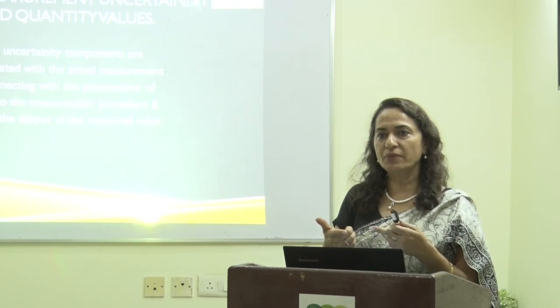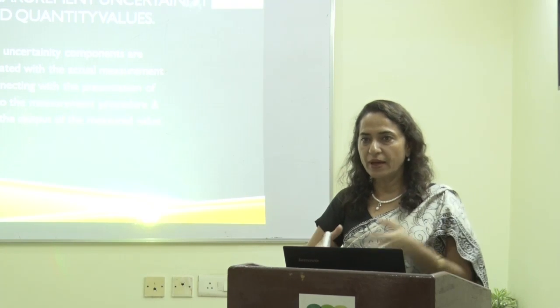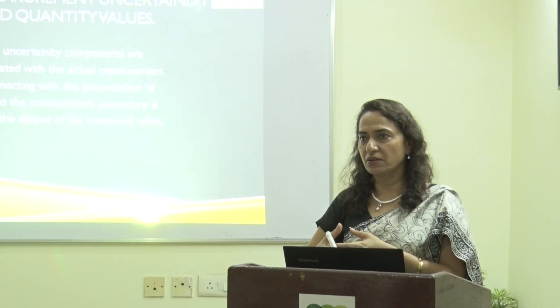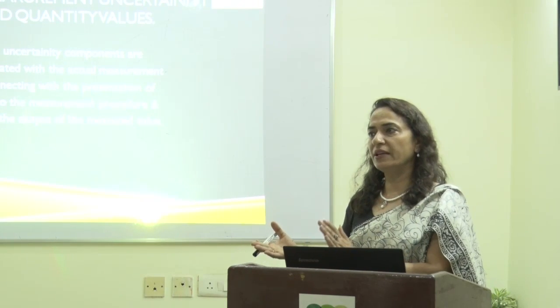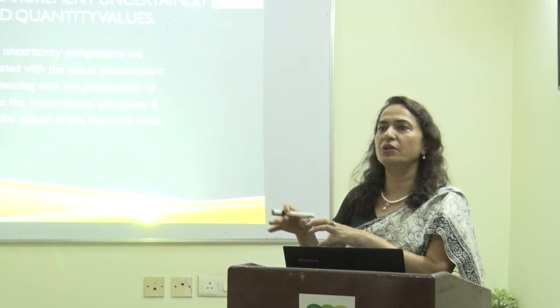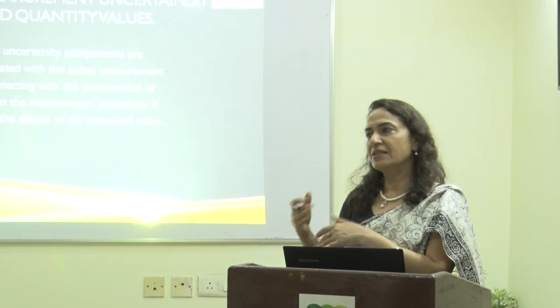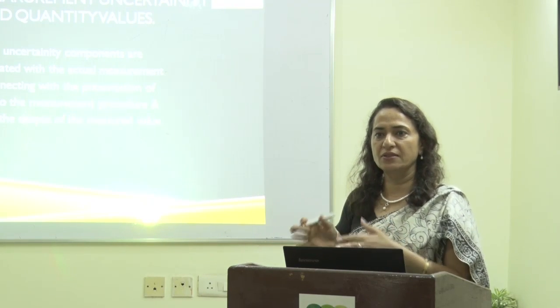As we are able to measure, now if you see, when we were doing ELISA, a lot of manual work was being done in ELISA, a lot of variation, high CV percentages. We have moved on to CLIA, CV percentages have come down, because there are many factors which now we are able to measure. As the advancement is happening, automation is happening, we are excluding certain uncertain factors.